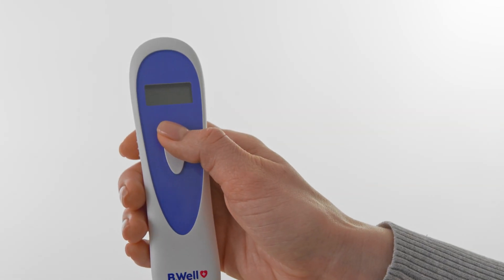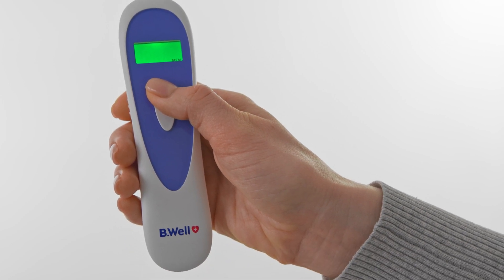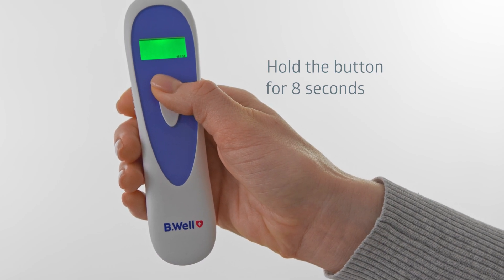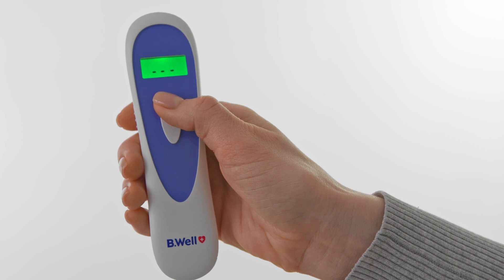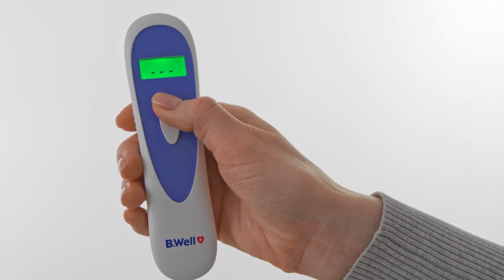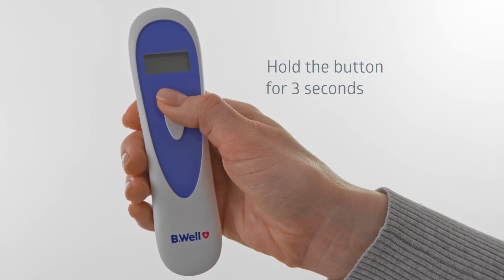This thermometer can display results in either degrees Celsius or Fahrenheit. Turn off the thermometer and long press the on button for 8 seconds until the Celsius or Fahrenheit signal is displayed on the LCD panel. Press the on button again to select the required scale, then long press the on button for 3 seconds to save your choice.